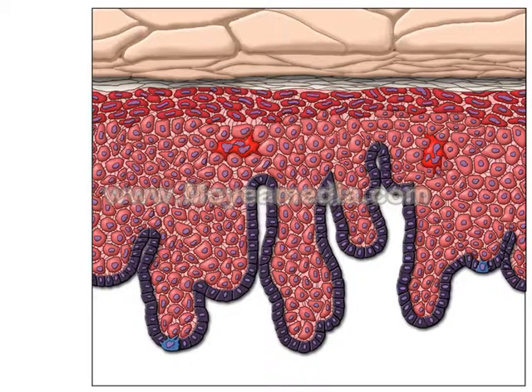In greater magnification, we see melanocytes as light blue within the basal layer, the basal keratinocytes in dark blue, the spinous layer above in pink, with Langerhans cells, dendritic, embedded as a darker red cell in this case. The granular layer is a darker red layer at the top, the stratum lucidum above that, and then the stratum corneum.